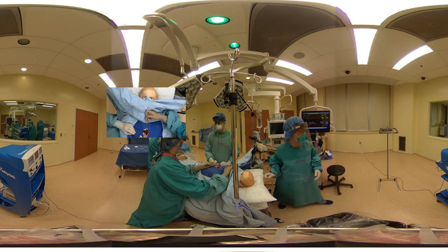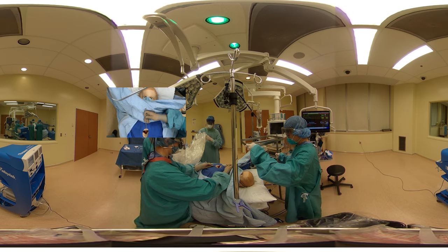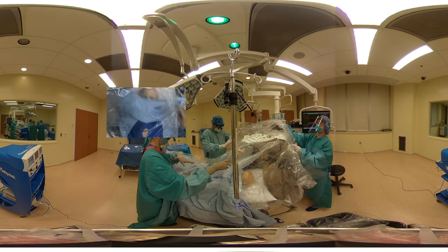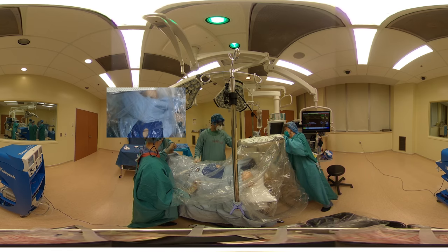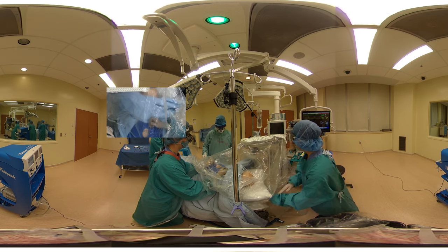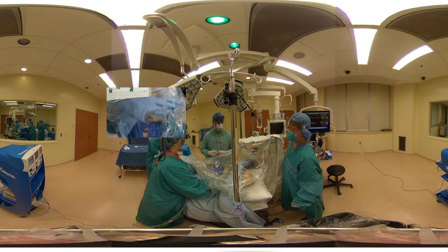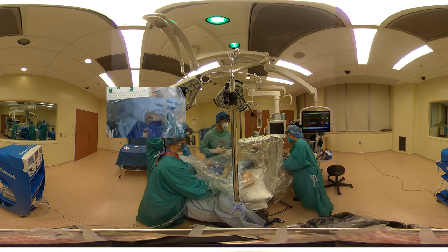We're going to get the hip fracture drape and set up a tent over the area. John, we're going to put a little special tent here — you can still take those nice deep breaths. To go over the plan: we will make our tracheotomy incision, get the tube in, connect, inflate the cuff, connect the in-line suction with the HME, and hand it off to anesthesia. They'll confirm end-tidal CO2 and then induce general anesthesia.